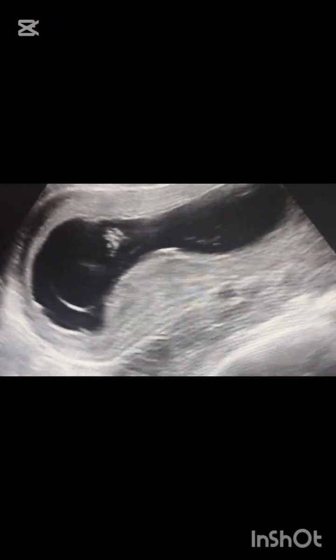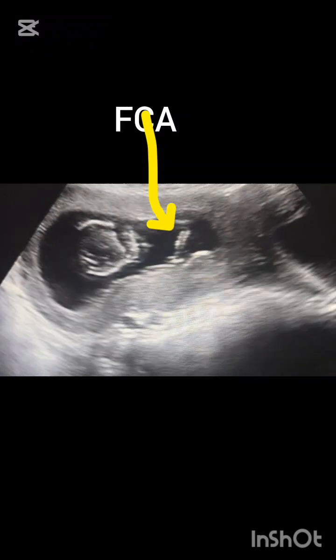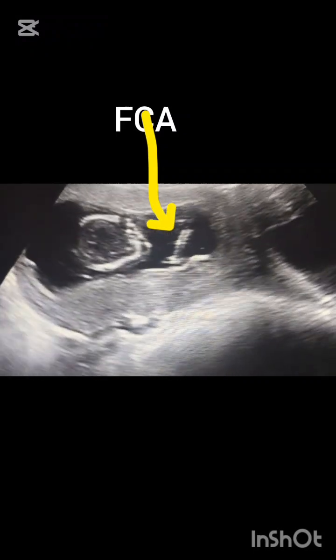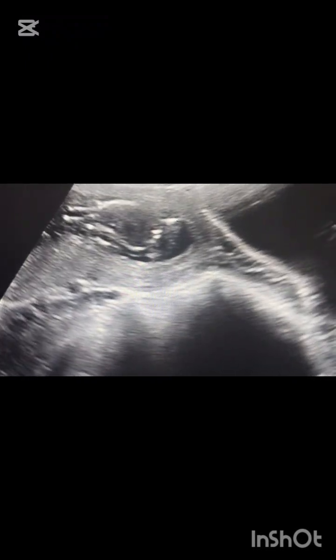There is no fetal cardiac activity and no fetal movement seen in this patient. This second video is showing intrauterine fetal demise. This patient presented with reduced fetal movement and not feeling the baby move.